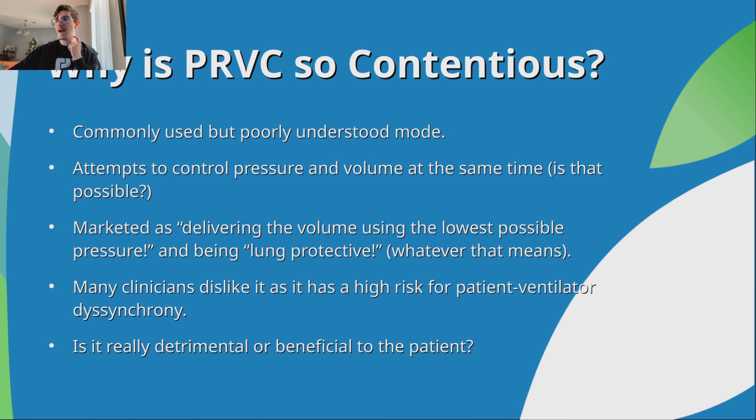Really, my biggest point of contention here is not necessarily the dyssynchrony thing, it's the marketing. Basically they make it sound like this magical thing where somehow your compliance is going to be better. Like you're going to get the same volumes using less pressure. Well, yes, but no. We're going to talk about that.